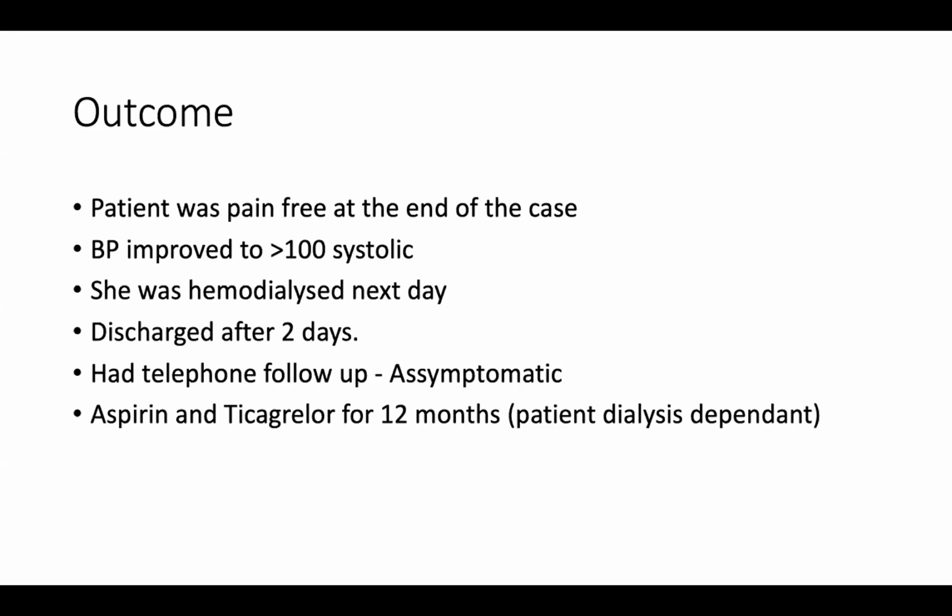Impella in a TAVI case, we have used those before, and in fact we've deployed Impellas in patients with critical severe aortic stenosis, and you'd be amazed that the Impella just drops across the stenosed valve. Occasionally you have to do a balloon angioplasty of the valve up front, but many of the times it will just go across the valve. We've written up our experience of that.